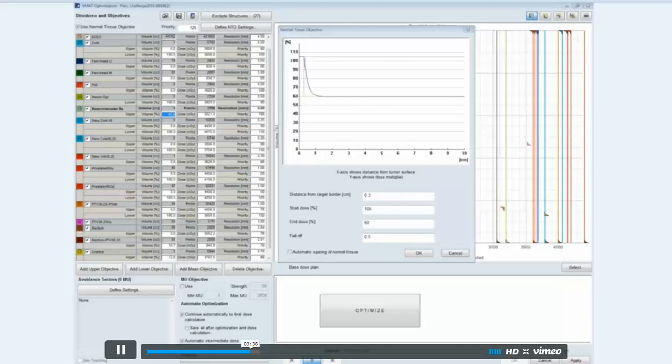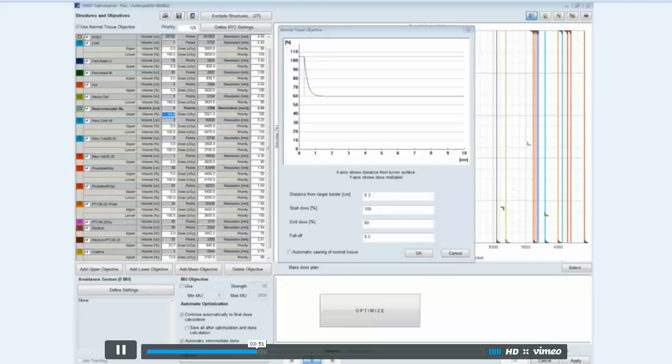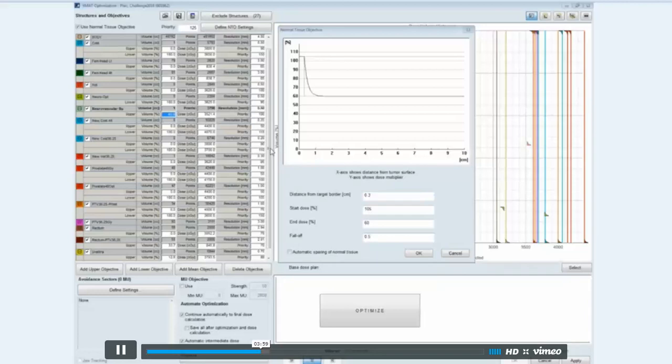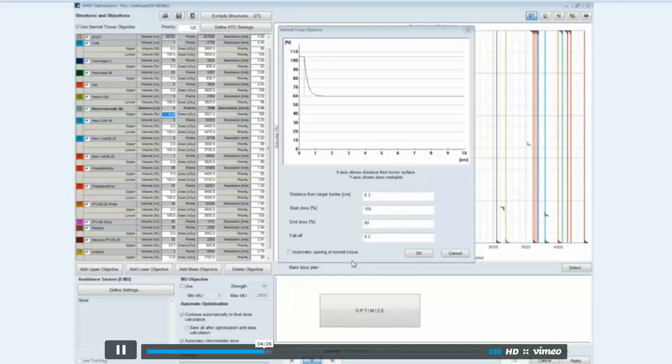There's usually, I usually notice a big change at step two, so I pause it again and watch it, make any changes I need to make within step one or two. I sometimes go back to step one if I need to make major changes. Once I'm happy with what I see, because I do this for pretty much every plan, and this is what I did for the plan challenge, I release it and let the optimizer go through to step three and four.